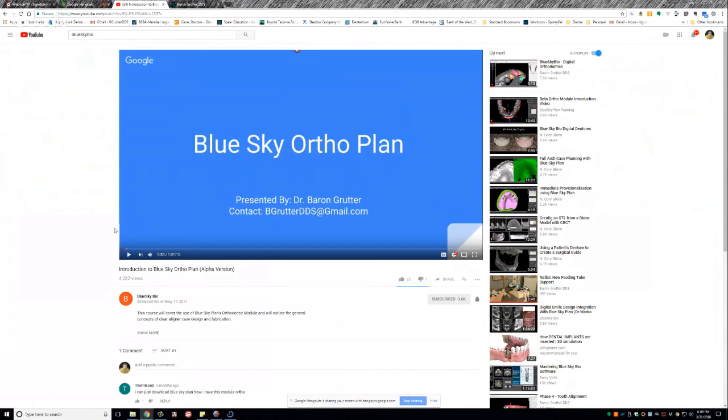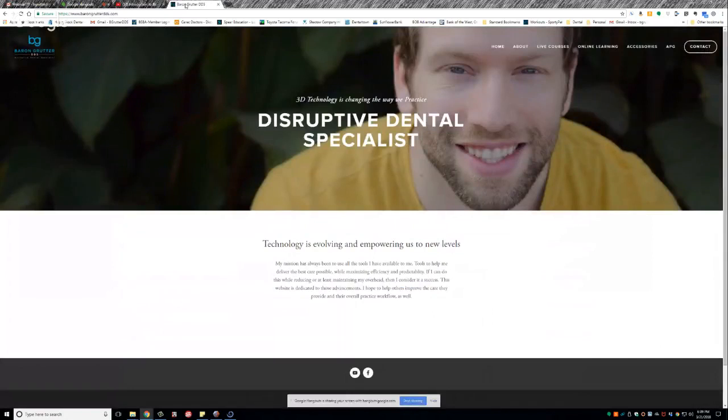So I didn't want to recreate those same slides and reinvent the wheel. If you've already watched it, I don't want to bore you too much, but it's there for your reference if you'd like. Really, what I'm going to focus on is just the updates in the software. I wanted to have as much time for questions as possible, and to go through some of the tips and tricks that I use in the software that aren't as straightforward. So I'm going to jump right into the software.